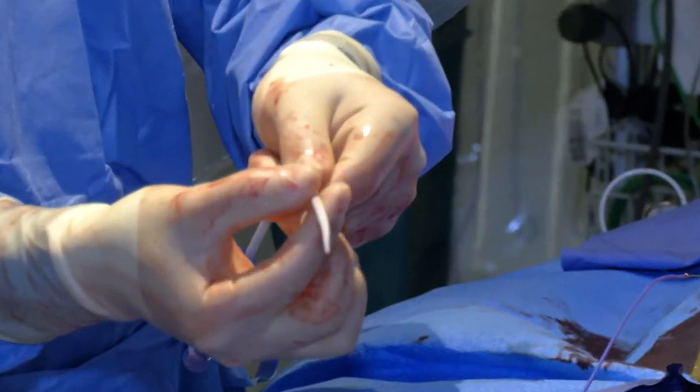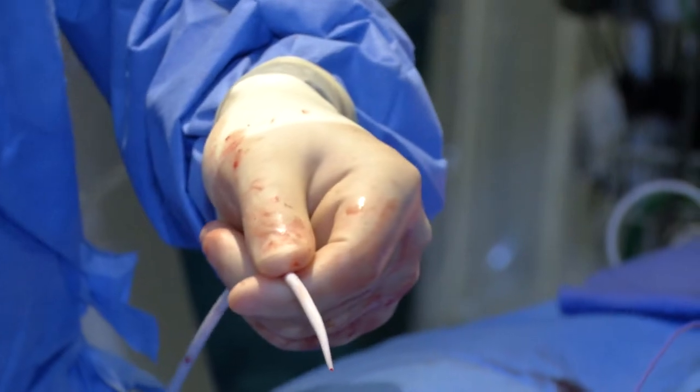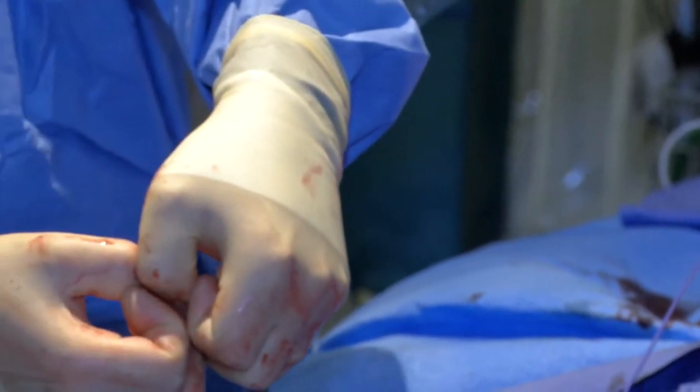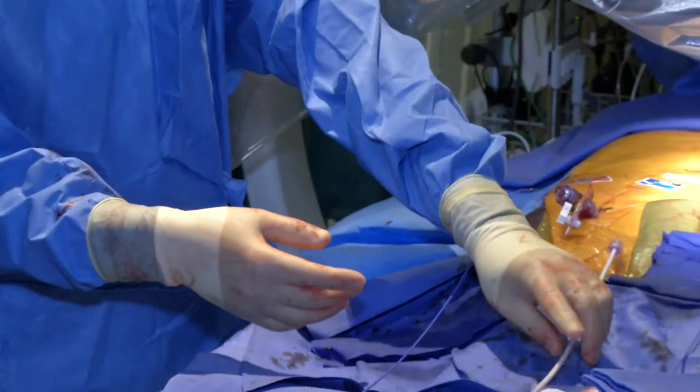So it starts big, and it allows it to gather up uniformly as it comes out. If you just pull the sheath out and go down on the sutures, sometimes you'll get puckering of the artery, and you'll have little tiny holes in it, and it'll leak from there. So it's more of a technique thing, and so we'll do it that way.